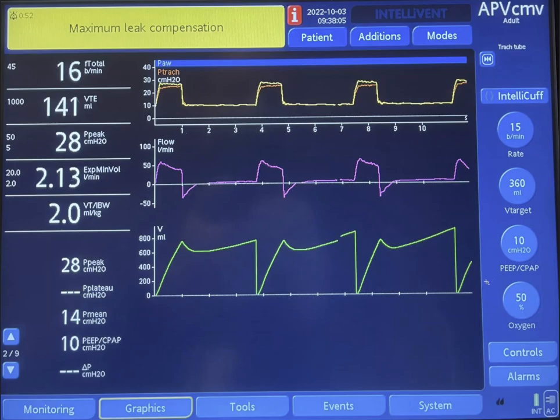The driving pressure — which is peak inspiratory pressure minus PEEP — the PEEP is attained, so the driving pressure is around 17 to 18 cm of water.